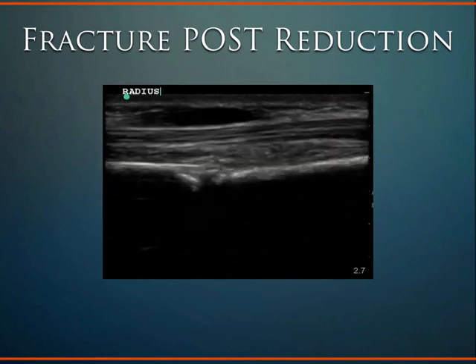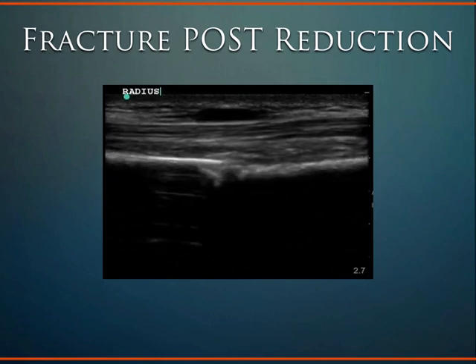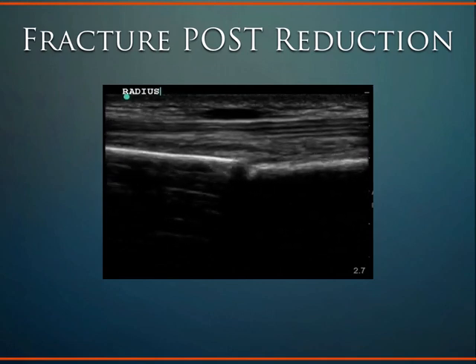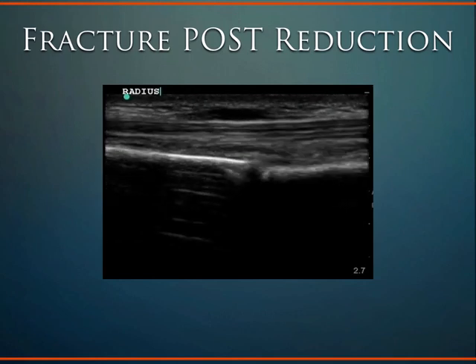And if you've ever done this clinically just by traditional methods, it can be quite cumbersome because you get the x-ray, you show the fracture, then you have to kind of have the x-ray up, you're looking at the x-ray, you're trying to visualize the fracture, and you're moving it in what direction you feel is appropriate and by protocol.